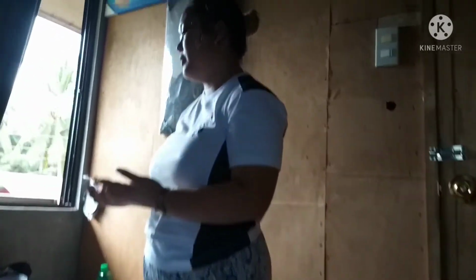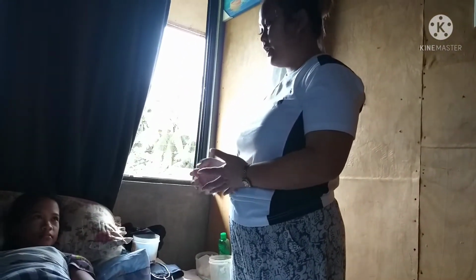Ma'am, today I will be getting your blood pressure. Have you smoked or drunk caffeine earlier?